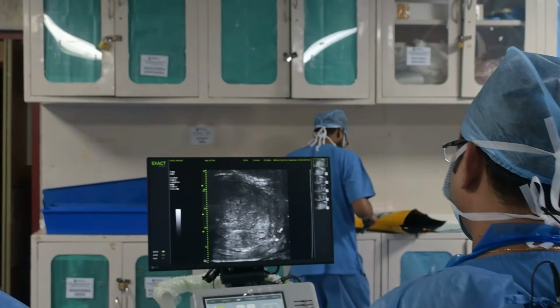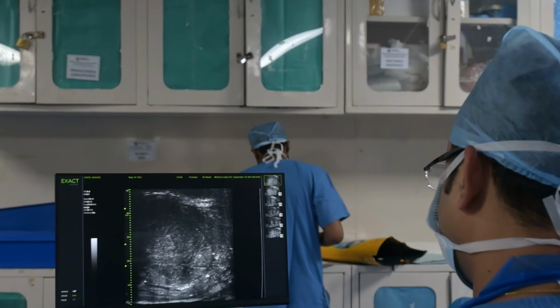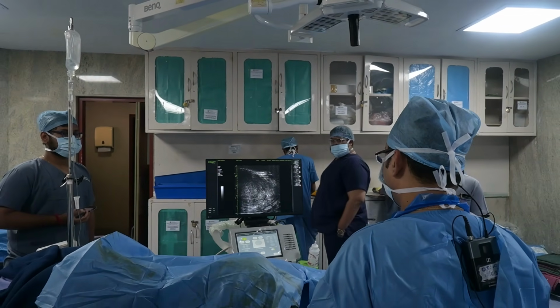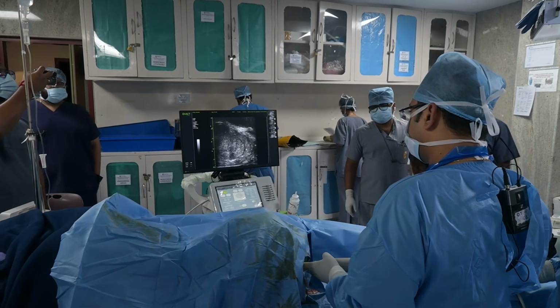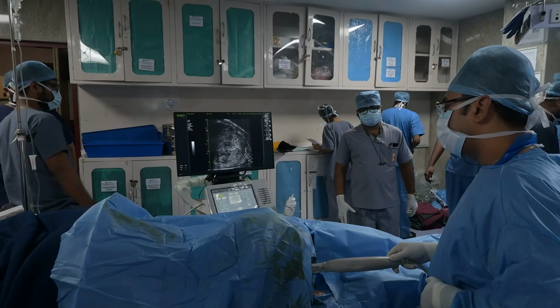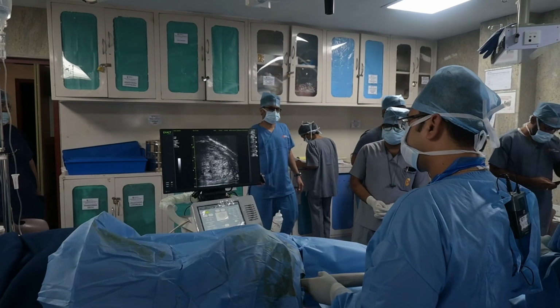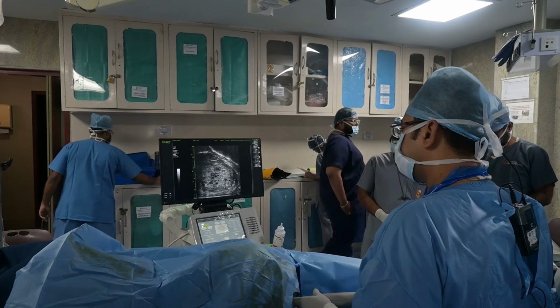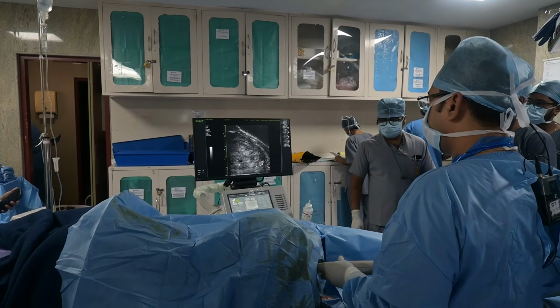Good morning. So, sir, I will try to demonstrate a micro-ultrasound guided transrectal biopsy today. As you would have seen, this is a 73-year-old gentleman with a PSA of 13. He has some comorbids. And what they have reported on MR is that there is a PI-RADS 5 lesion in the transitional zone. Now, if you look at the characteristics of MRI, the peripheral zone looks quite compressed, and the findings are more of a benign disease rather than malignant.